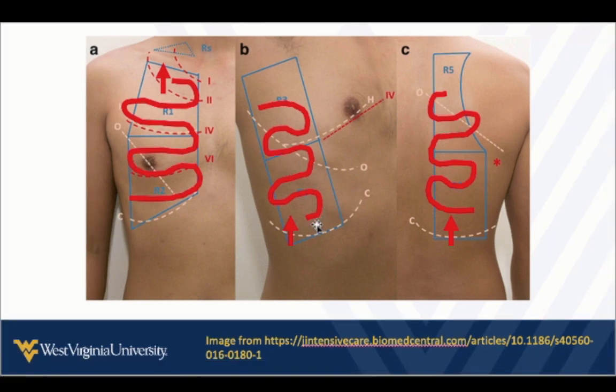Then when I come out to the side, I like to start down low and find the diaphragm first so I know where I am, and then do the same thing, just zigzag my way up the side of their chest, all the way. You really got to get yourself into their axilla. If you're not feeling nasty, sweaty armpit sweat, then you haven't gotten high enough.